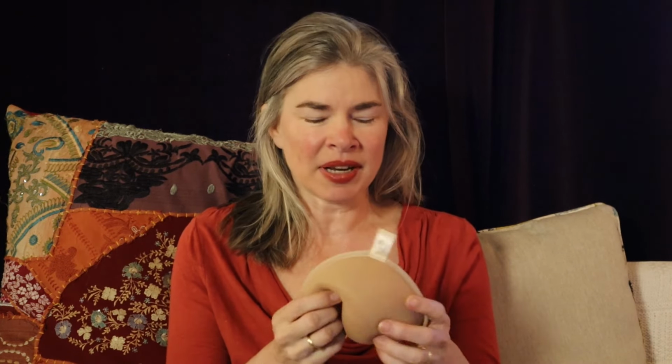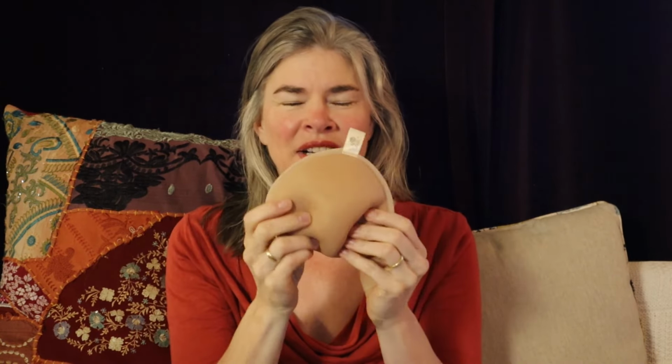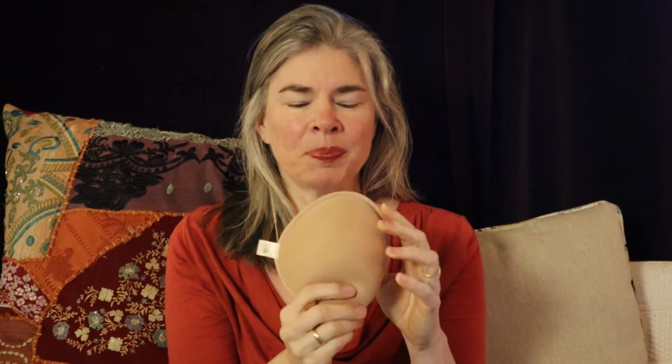So I learned this and I ordered a couple of swim prosthetics and I got them in the mail this week, and I just wanted to show you. The ones I chose are not made of silicone. They're much more lightweight. They're made of polyester, and it's a very meshy fabric. And the reason it's meshy is because it is going to allow water to flow through it from front to back and up to down. In every direction, it is designed to allow water to flow through.